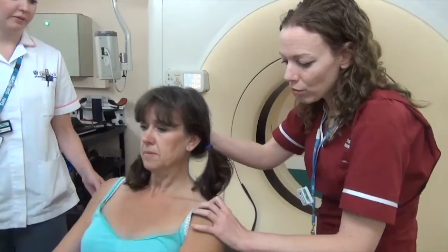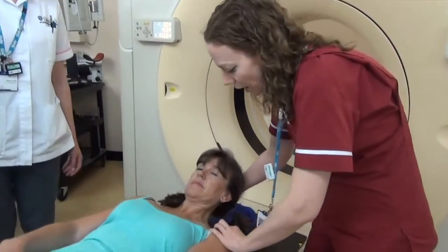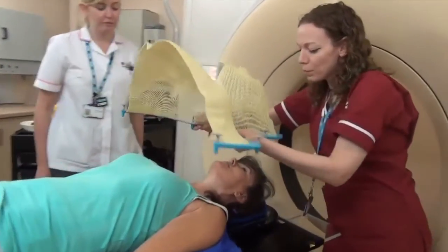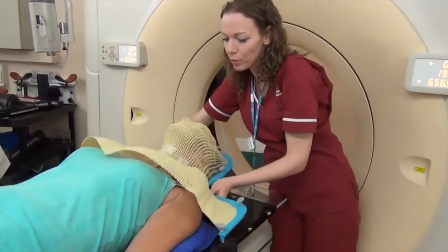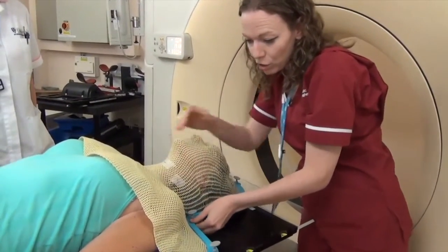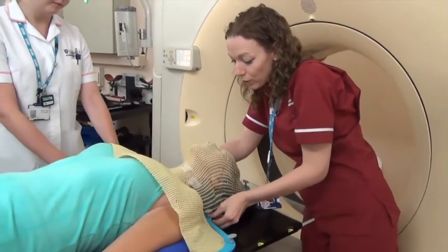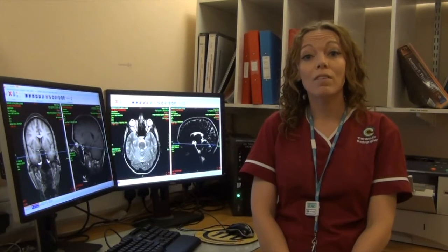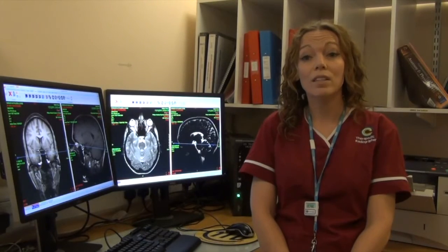The next part of the process involves the patient having a CT scan in exactly the same way they were immobilised in the mould room, using the same immobilisation equipment. For a head and neck patient, that would be the cast or mould made of their head. The patient is laid on the treatment couch in the same position with the mould on. The mould has two purposes: to keep the patient still for accurate treatment, and to allow skin marks to be placed on the cast rather than directly on the patient, making the treatment very accurate.